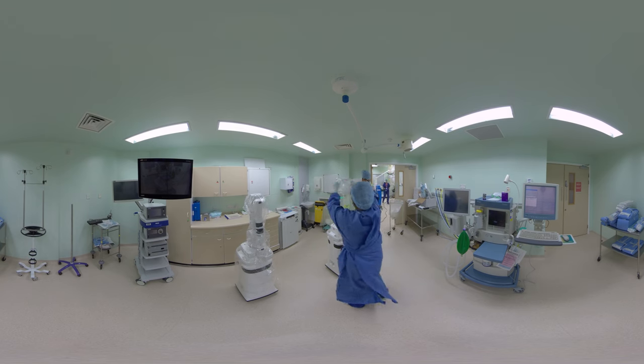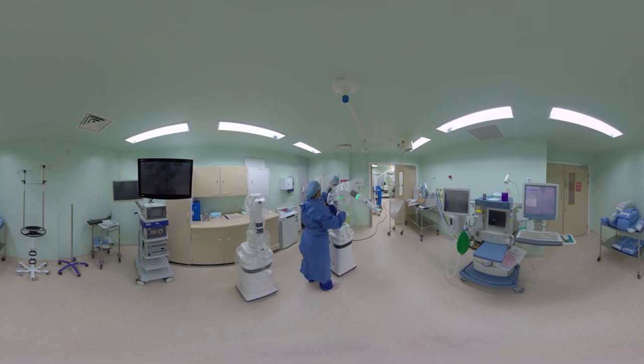Today, I'm going to show you a cholecystectomy performed with the Versius Surgical Robot. This is a 360-degree video, and you'll be able to scroll around and explore the theatre or watch it with a VR headset. You can now see the Versius system being draped for the surgery.